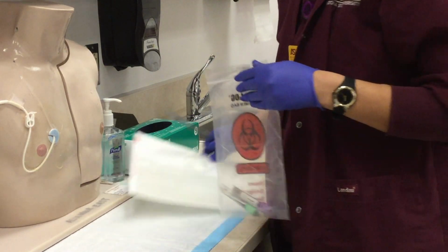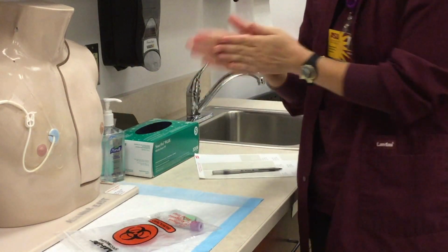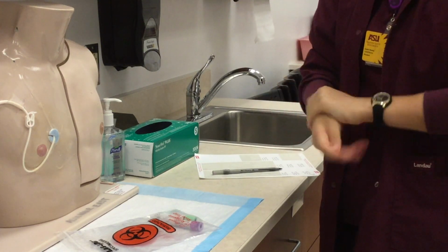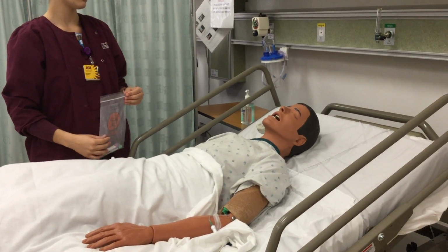Now you can remove your gloves and perform hand hygiene. You will perform documentation, including your assessment of the insertion site before beginning, any difficulties during the procedure, the time and date the labs were drawn and sent to the lab, and the patient's response to the procedure. Make sure to clean the environment, perform hand hygiene, and lower the bed.